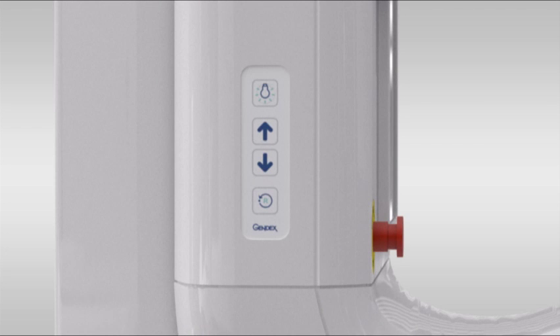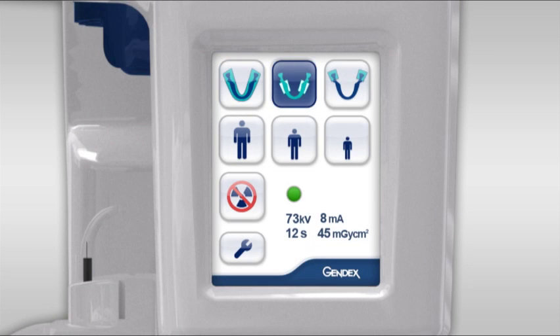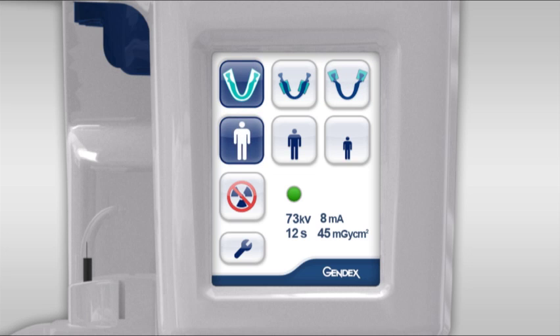The column control has the laser alignment lights button, up and down buttons, and a reset button. The touchscreen selections include projection type, body size, no dose simulation, and additional settings displaying system status and dose information.